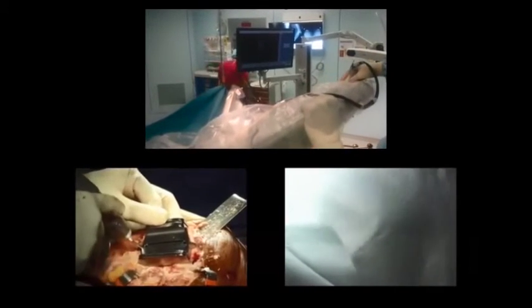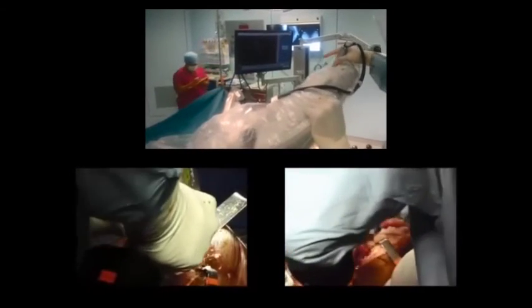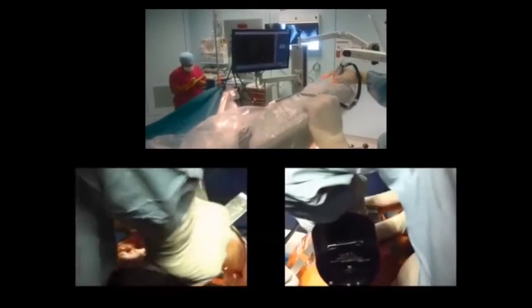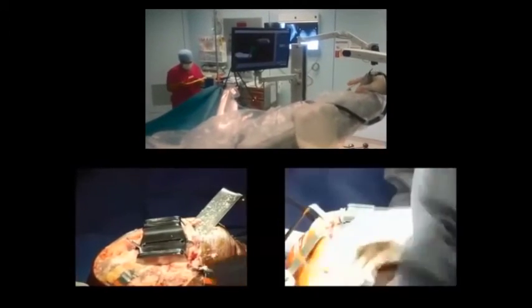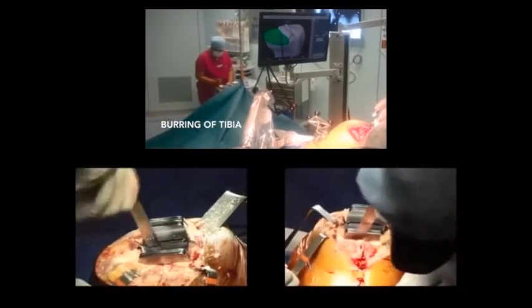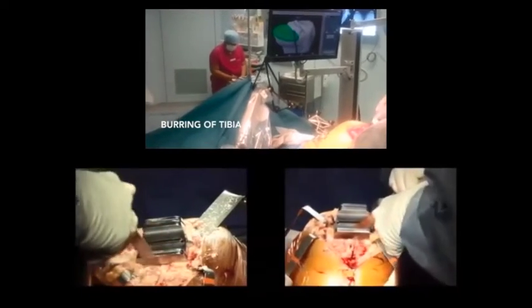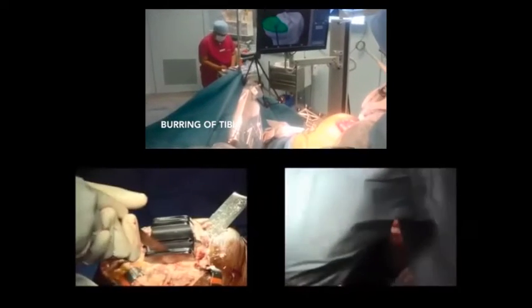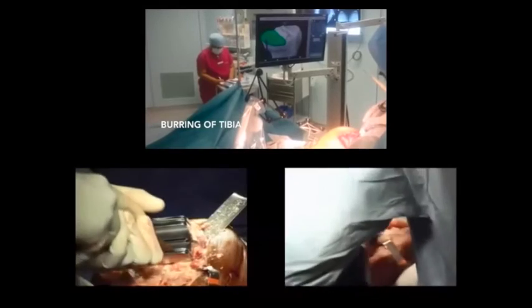You'll notice a lot of this is essentially registration because there is a lot of planning that goes on within the surgical time. Whereas if you compare what's being done below, you can see that a lot more of that time is spent with the surgical procedure per se. You can see on the bottom right-hand corner where the tourniquet isn't used, there's a fair bit of bleeding already begun.